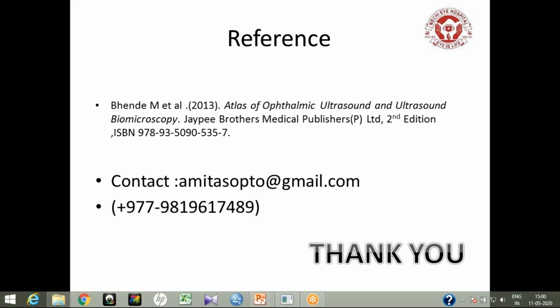Or you can do a scan in the erect position also. If in the supine position there is an elevation, but if you do the scan in the erect position, then due to gravity, the fluid goes down. Okay, sir, it is clear.